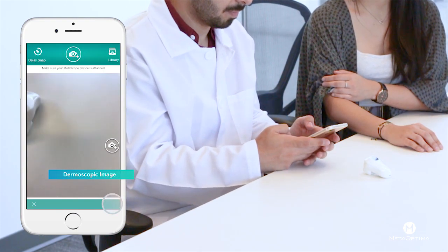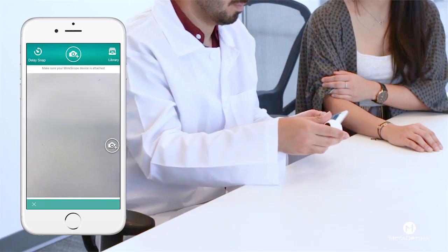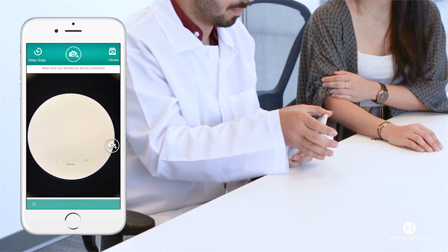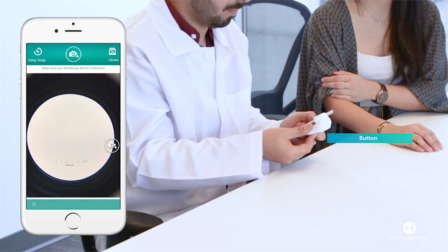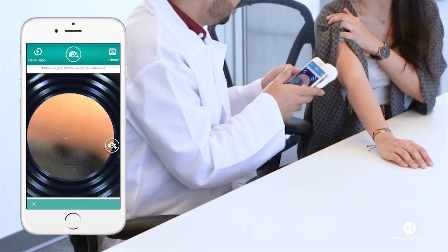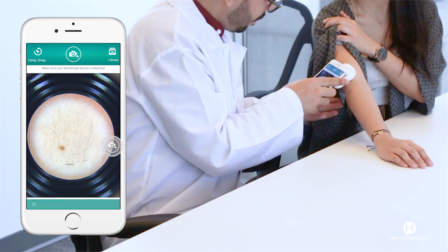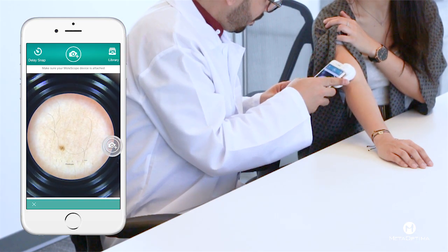To take the dermoscopic image, tap the Molescope icon in the bottom right corner. Then, gently attach the Molescope to your phone and turn on the device's light when ready. Tap the screen to help focus the image, and when ready, take the image by hitting the camera icon. Remember to tap to focus on the spot.